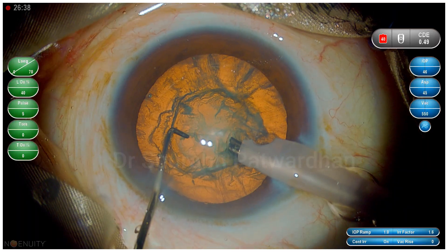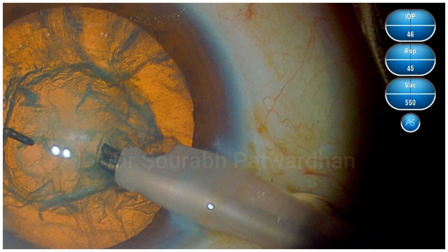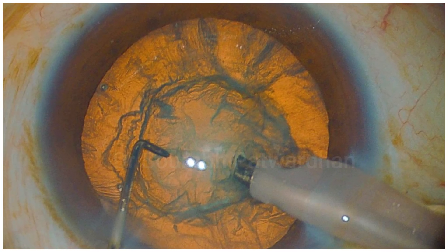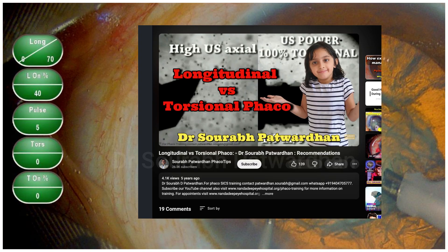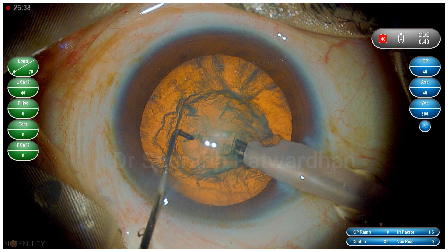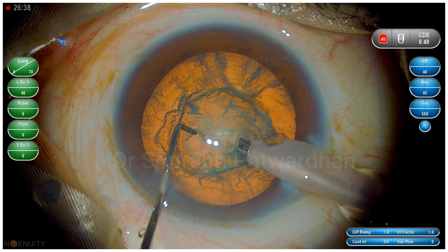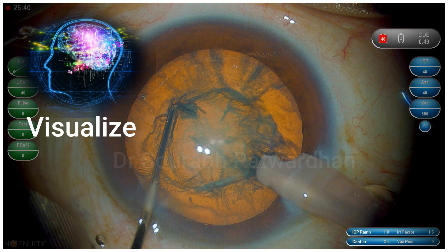Before we start, we must understand the parameters we are going to set. I always use high flow rate on panel mode and high vacuum again on panel mode, and I always use longitudinal pulses with 40%. For why longitudinal, you can watch the video I have put up on YouTube earlier. With these parameters I am going to start.